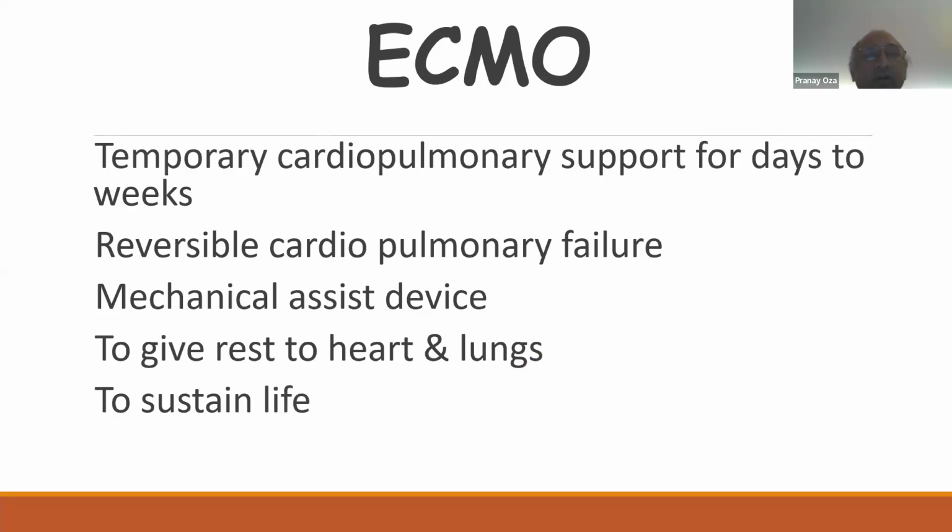See, all of you know now that ECMO is a temporary cardiopulmonary support. It's for reversible cardiopulmonary failure. It's a type of mechanical assist device, basically made to give rest to the heart and to the lungs and to sustain life.